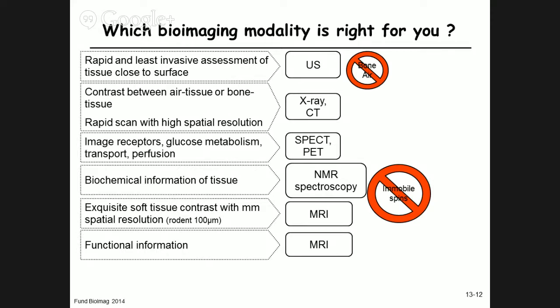Certainly for neurosciences, that happened about 25 years ago. Here with MRI, because it's T2 star contrast for functional MRI, air-bone, air tissue interface, anything close to the air tissue interface is no good. So close to the ear canal or the sinuses, those areas are difficult to measure.